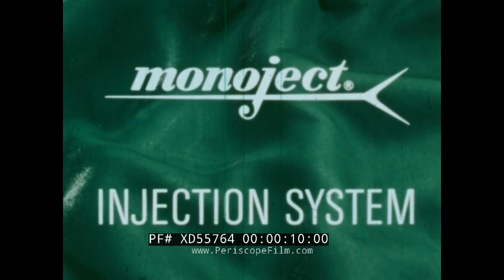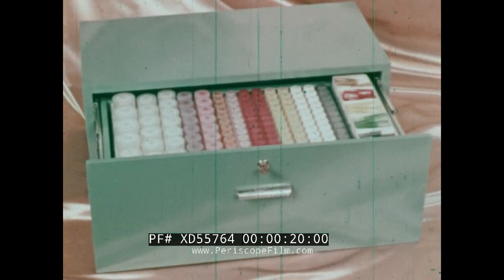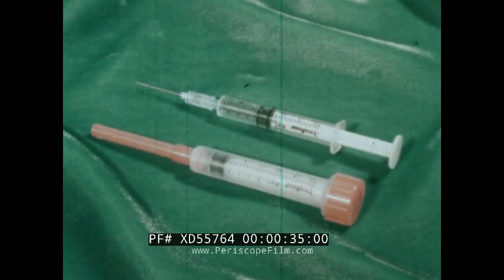The Monoject Injection System presents a sequence of safety using the sterile platform technique that protects the patient, all hospital personnel, and the community. When you twist the cap to break the seal of the exclusive rigid Monoject syringe and needle package, you begin a sequence of carefully guarded safety procedures which characterizes the entire Monoject Injection System.